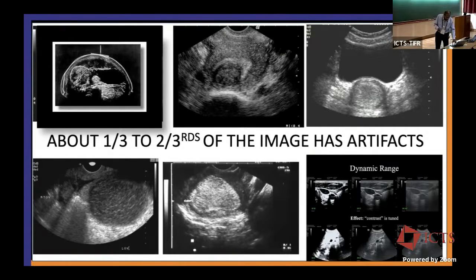So this was the ultrasound image many years ago, which was almost only black and white. Today the amount of gray scaling actually helps us to identify finer details in the image. And I'm able to say this is the uterine myometrium, this is the endometrium, and this is a small little fibroid which is just pressing on the endometrium. The fibroid has a small capsule which is what we call anechoic, a black area.